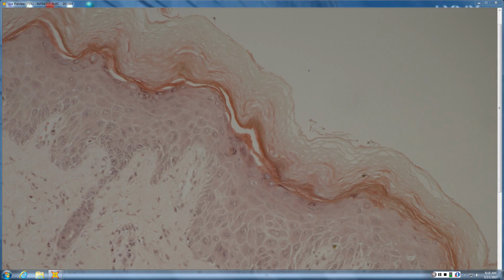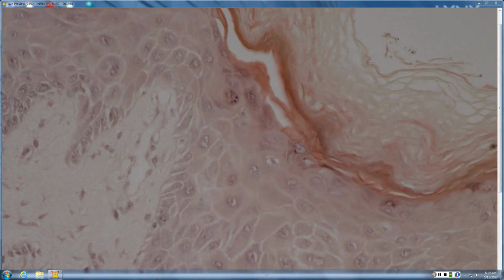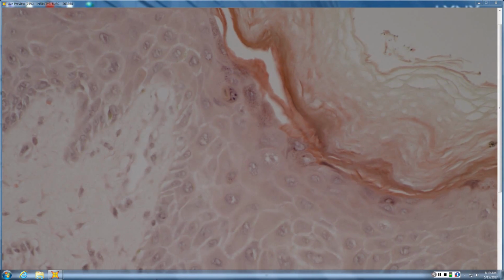And is your basal layer intact? Yeah, it's intact. I mean, maybe a couple of the sites, but they're hard to see. So basal layer is usually columnar. Yeah. Are these columnar or just squamous cells? No, they just look like squamous cells. So your basal layer is totally gone. You have a few vacuoles with lymphs, but they're few in number.